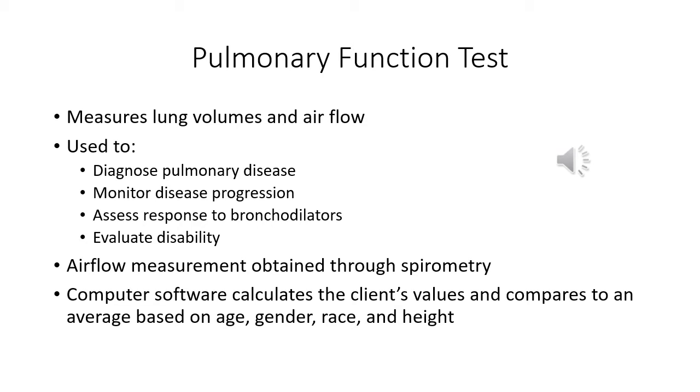Airflow measurement is obtained through spirometry. A computer's software calculates the client's values and compares to an average based on age, gender, race, and height.